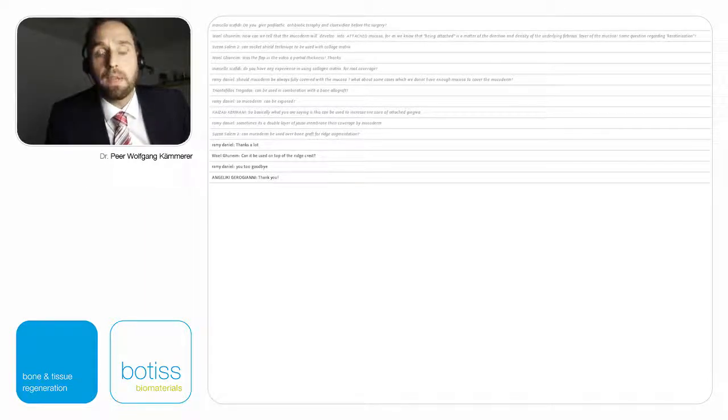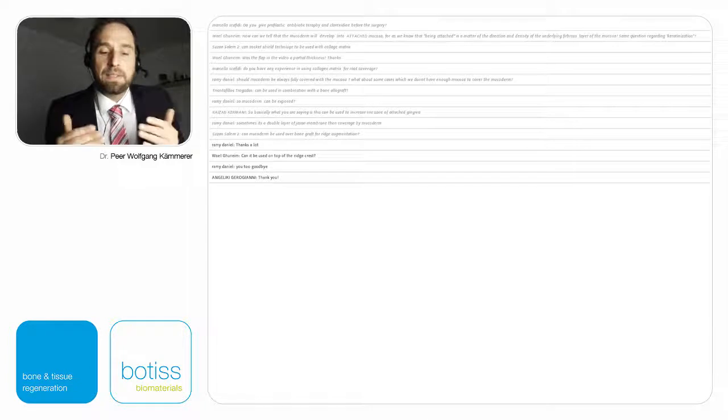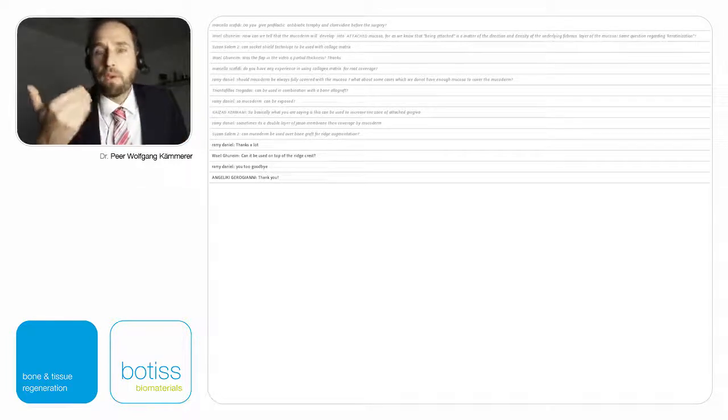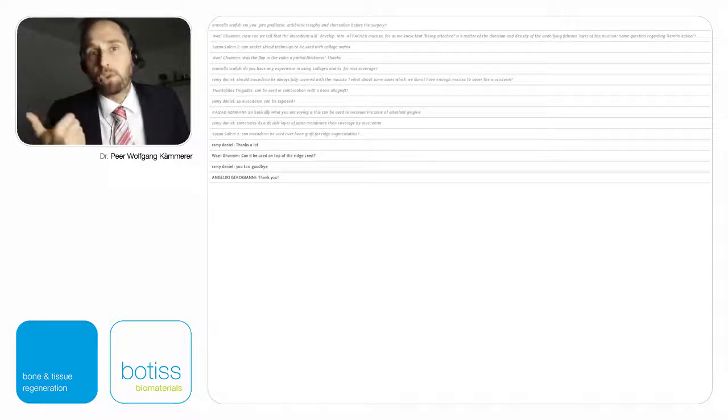I think that a small part of it gets integrated, but the whole thing is more a protection against bacteria, against everything from the mouth. So it's a protection, a shield, and under the shield the epithelium will grow undisturbed.